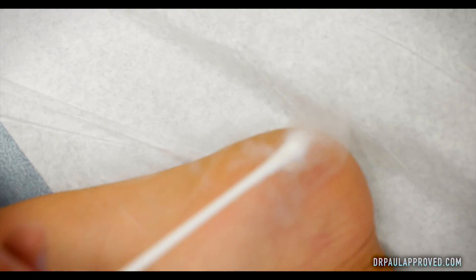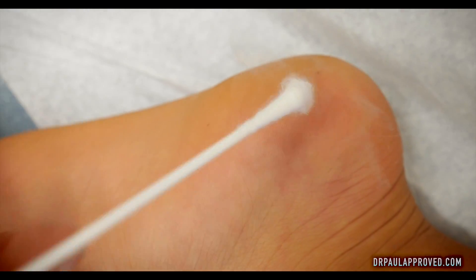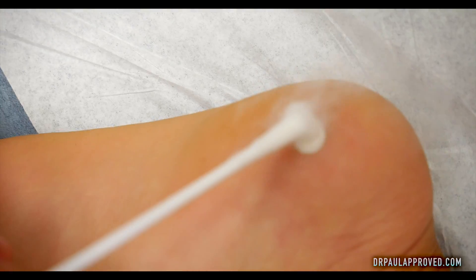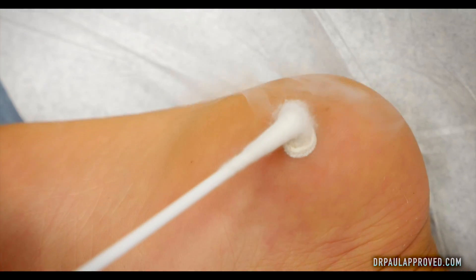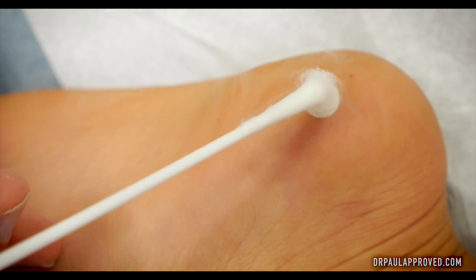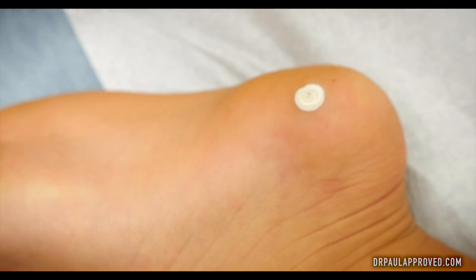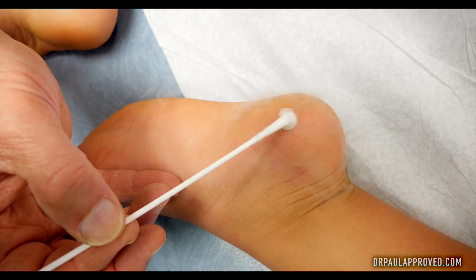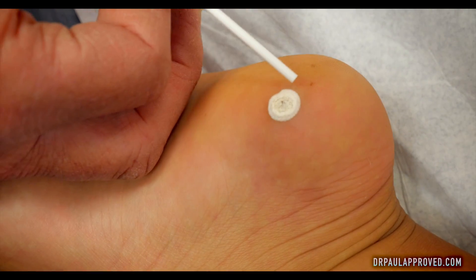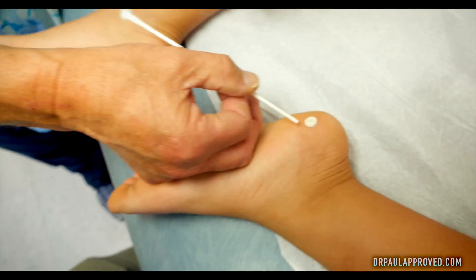It hurts, kind of. Does it hurt already? It just normally hurts. Do you have any pets at your house? Yes, we have a dog. You have a dog? What's your dog's name? Lucy. Like I Love Lucy? You'll see how it's all white — we wanted to freeze a little bit more than just the wart. So with the wart's white, we got a little bit of normal skin frozen too.